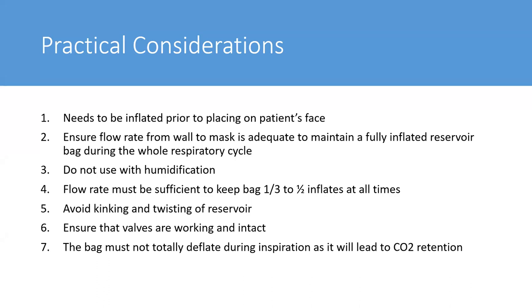To ensure the highest concentration of oxygen, the bag needs to be inflated at all times, and in fact should be inflated before placing it on the patient's face. Okay. Make sure that the flow rate from the wall to the mask is adequate to maintain a fully inflated reservoir during the whole respiratory cycle.